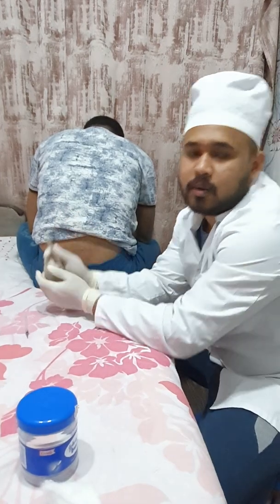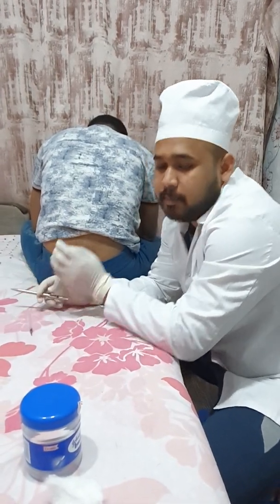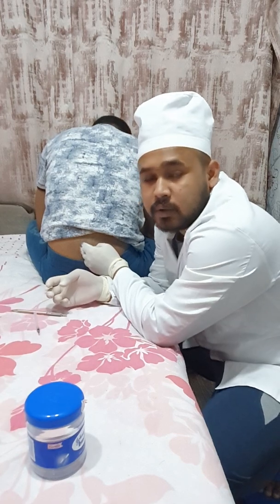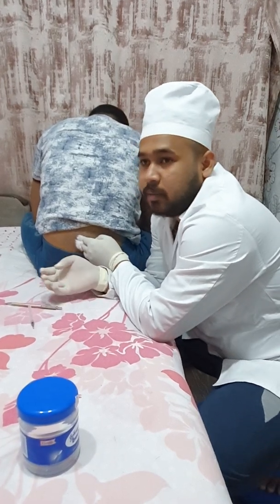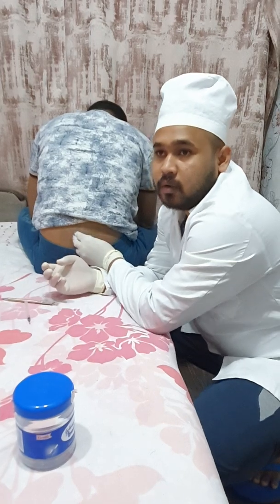So this is all about lumbar puncture. Now I will apply a bandage to the area through which the lumbar puncture is done, and I will ask the patient to lie down for 30 to 40 minutes, and further if there is any pain complaint by the patient, I will give him simple acetaminophen or paracetamol for pain relief.